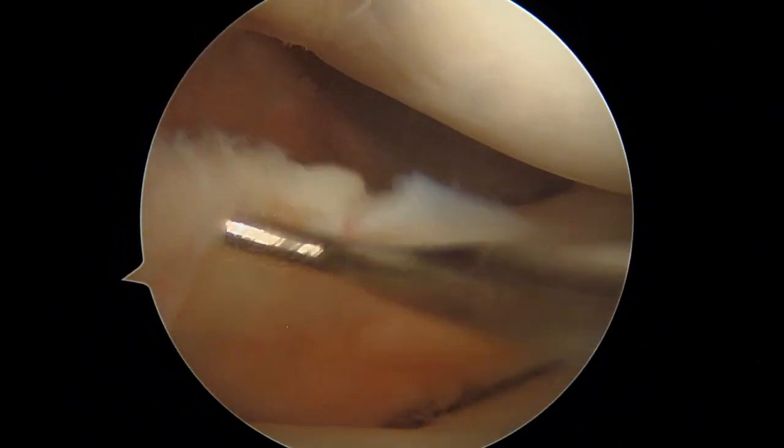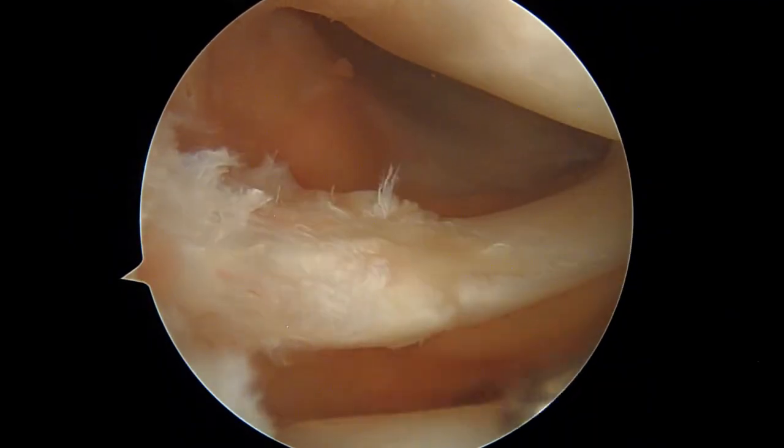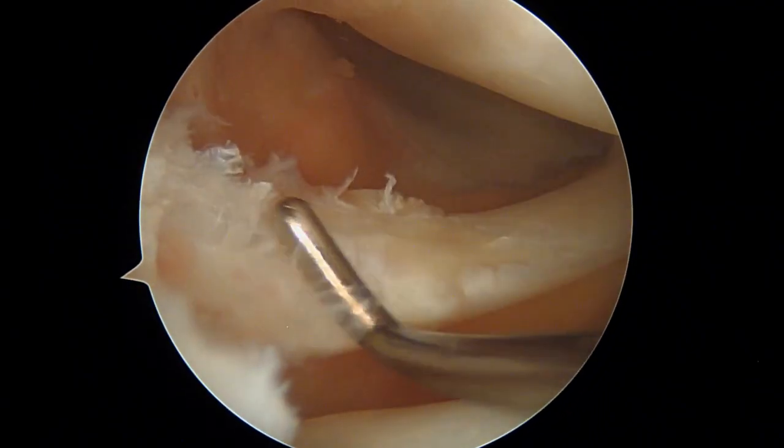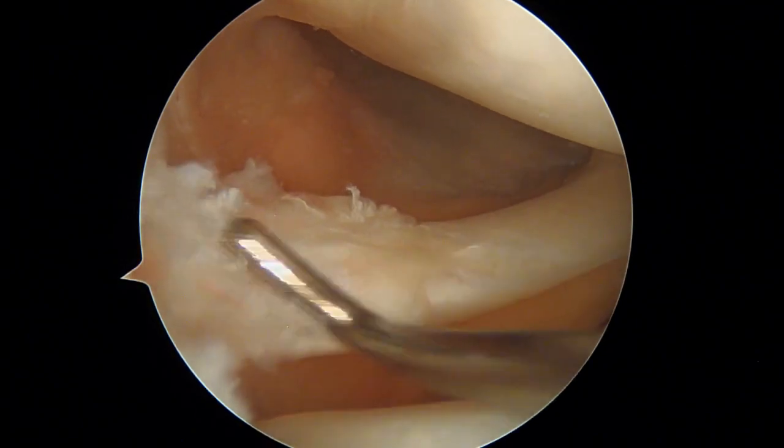Then we introduce our probe in order to assess and confirm the stability and regularity of our result. As we can see, there is not anymore any unstable fragment on the posterior horn of the lateral meniscus.